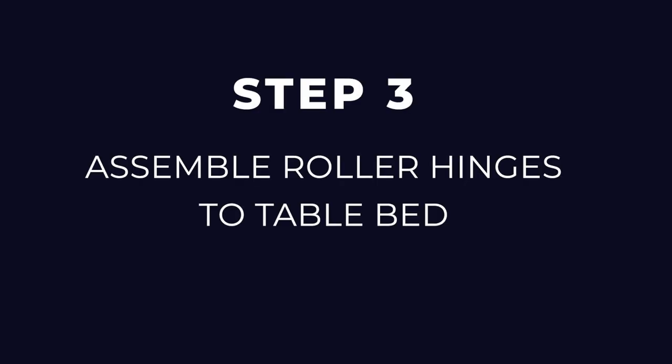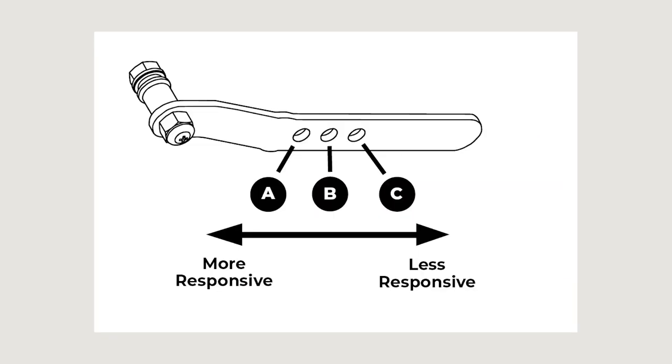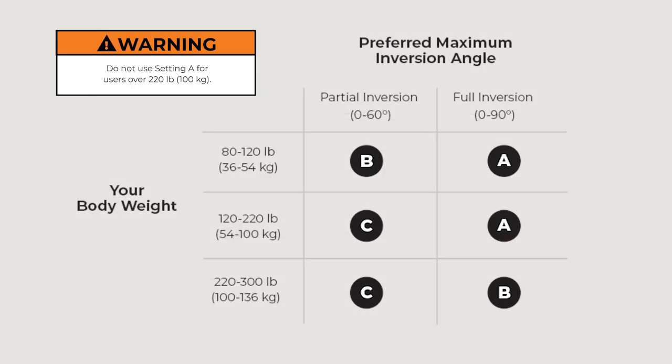Step three: assemble roller hinges to table bed. Familiarize yourself with the three-hole roller hinge. The roller hinges control the responsiveness or rate of rotation of the inversion table. There are three holes — the hole selection depends both on your body weight and your preferred angle of inversion. The A setting is the top hole closest to the pivot pin, B is the middle hole, and C is the bottom hole. Determine your recommended hole selection using the chart shown. Your roller hinge setting and balance may vary depending on your body weight distribution. Please refer to the user guide for troubleshooting.